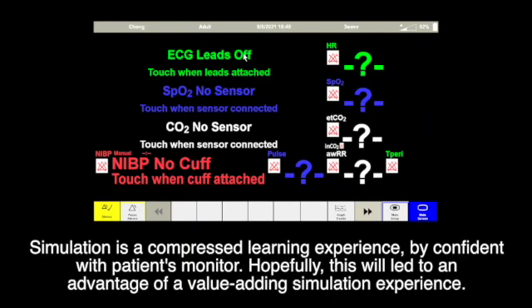Simulation is a compressed learning experience. By gaining confidence with the patient monitor, hopefully this will lead to a value-adding simulation experience.